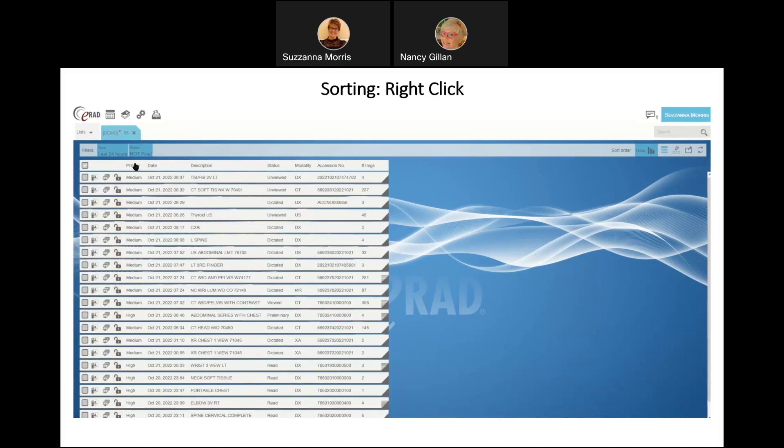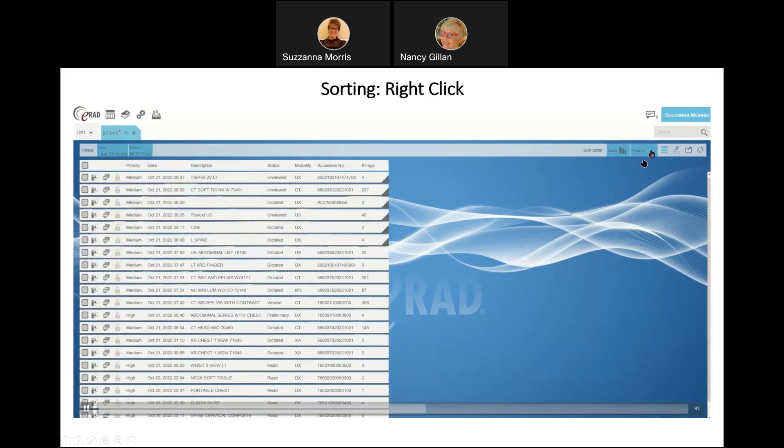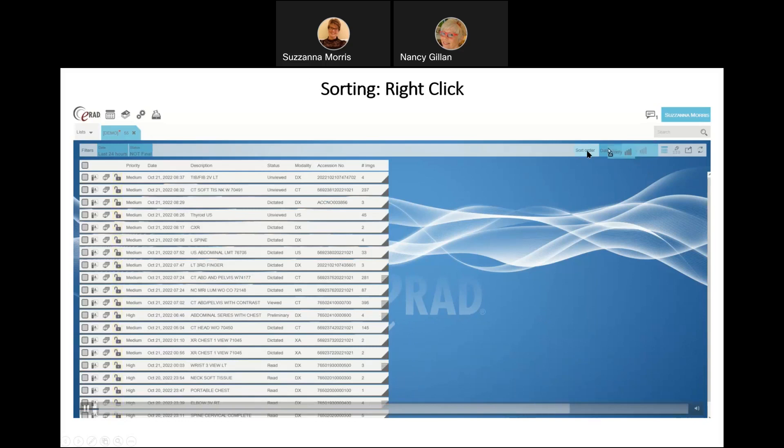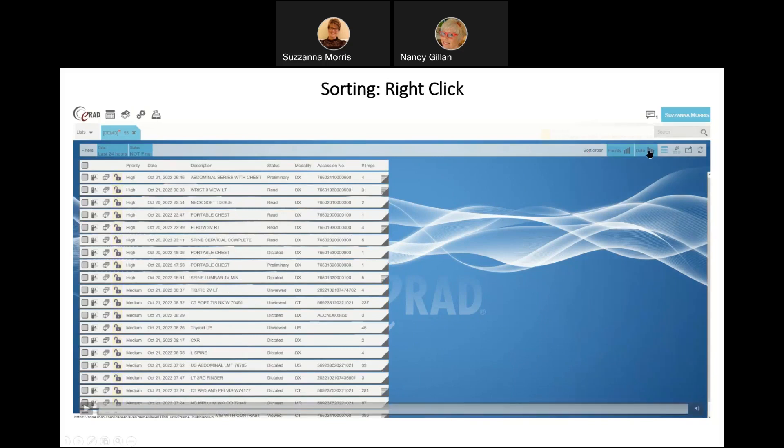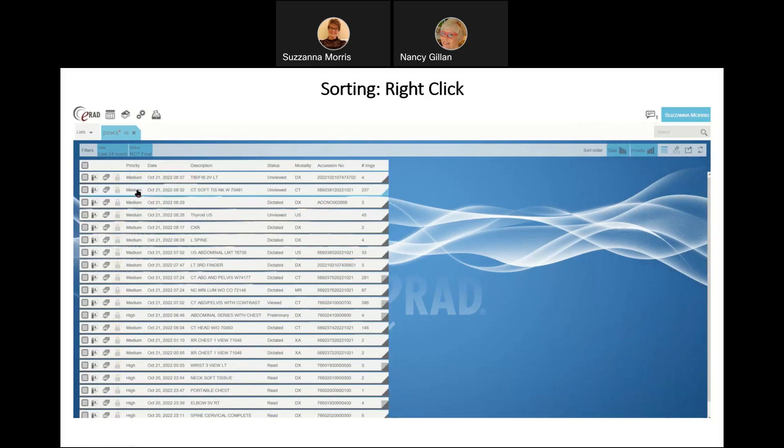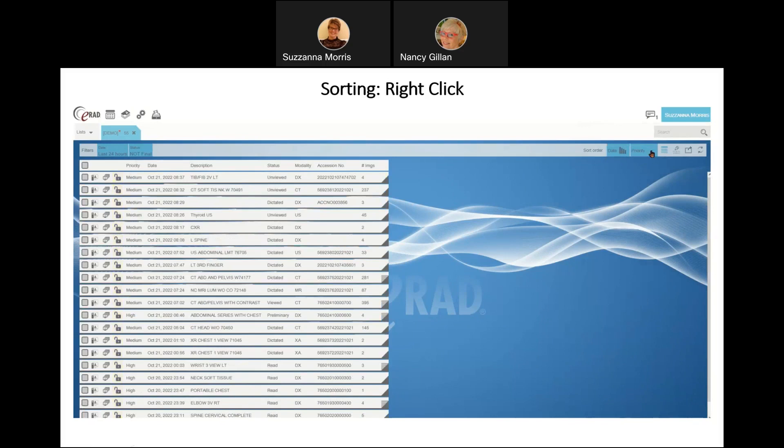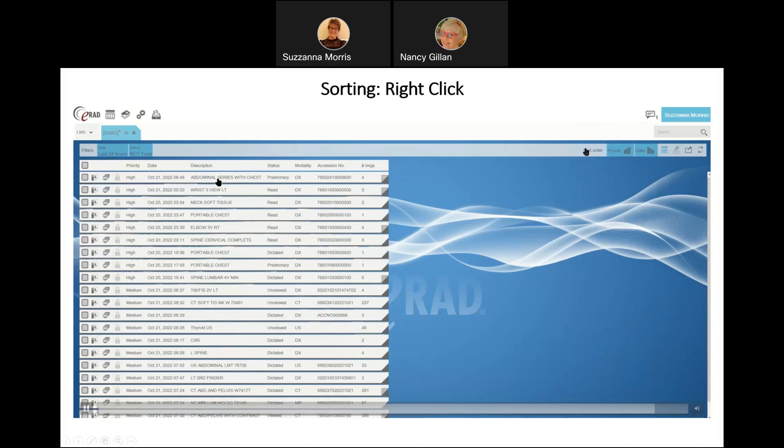Another way that you can sort is by right-clicking. In this example, I'm going to sort by right-clicking on priority, and it placed priority behind my date. But I want my priorities to show up, and I want this list to sort showing me my priorities over my date. So what I need to do is pull my priority over and put it in front of my date. We're going to right-click and sort on priority. It automatically places it behind the existing sort. In order for this to pull my priority of high up to the top of the list, I need to place that priority sort in front of date. Now you can see all of our priorities have sorted to the top, and then our date sorting criteria kicks in after that.